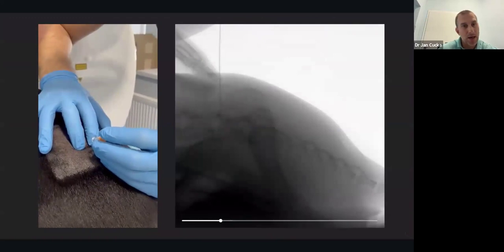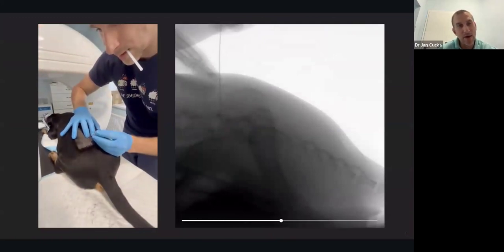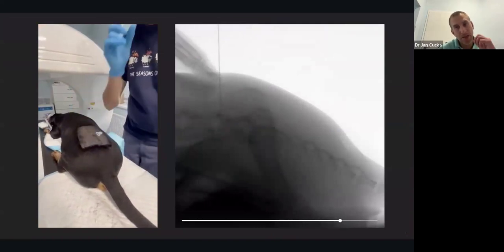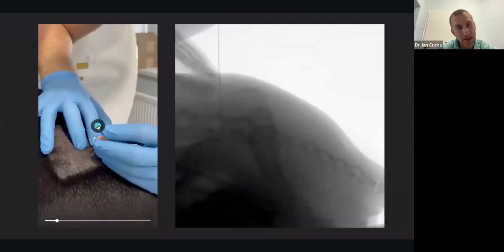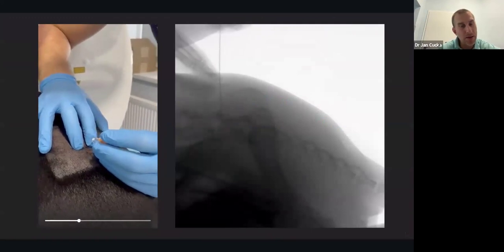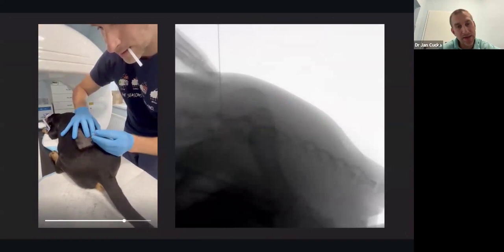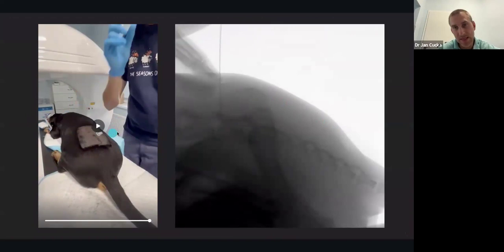This is a parallel video of the puncture and fluoro. So you can see once more the application between L6 and L7, and when I am in, that's done.